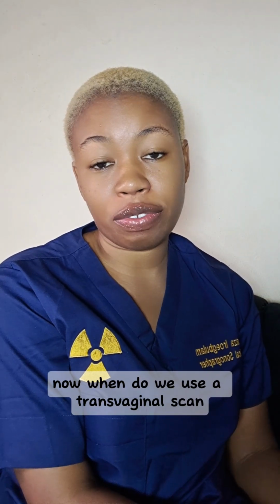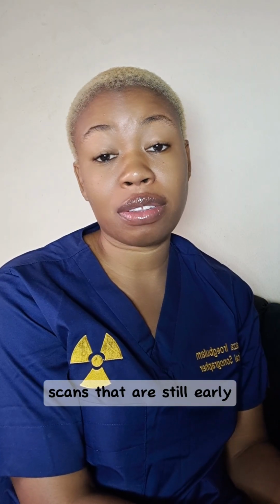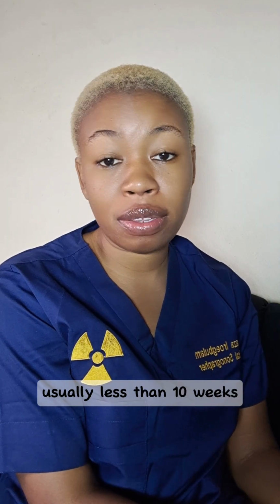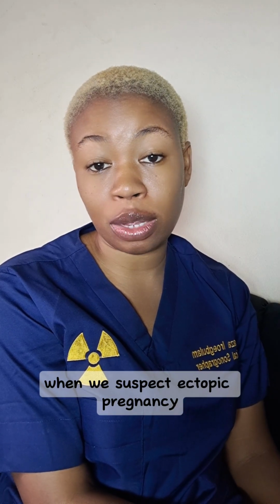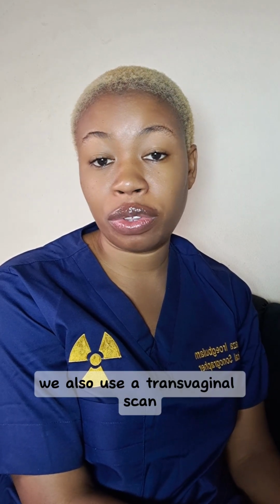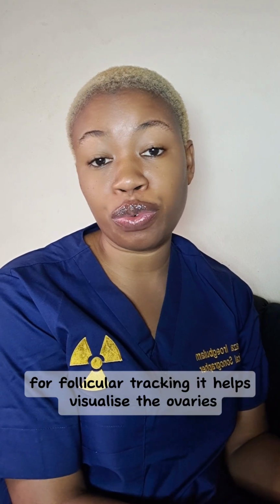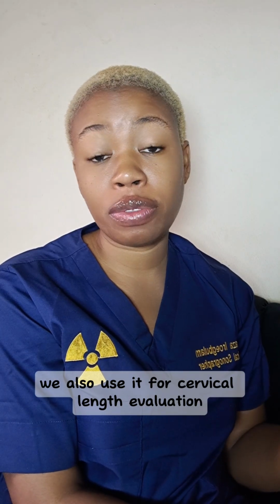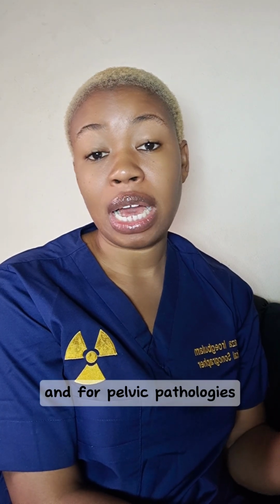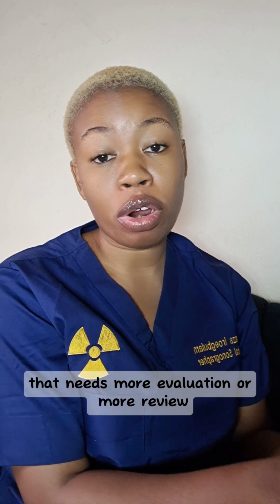Now, when do we use a transvaginal scan? Usually, we use it for pregnancy scans that are still early, usually less than 10 weeks. We also use it when we suspect ectopic pregnancy, and for follicular tracking. It helps visualize the ovaries, the uterus, and the endometrium better. We also use it for cervical length evaluation and for pelvic pathologies that need more evaluation or review.